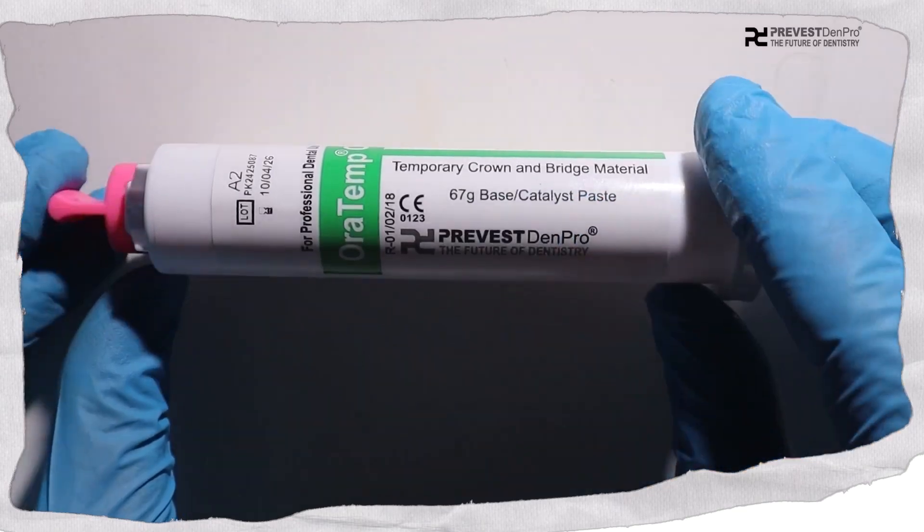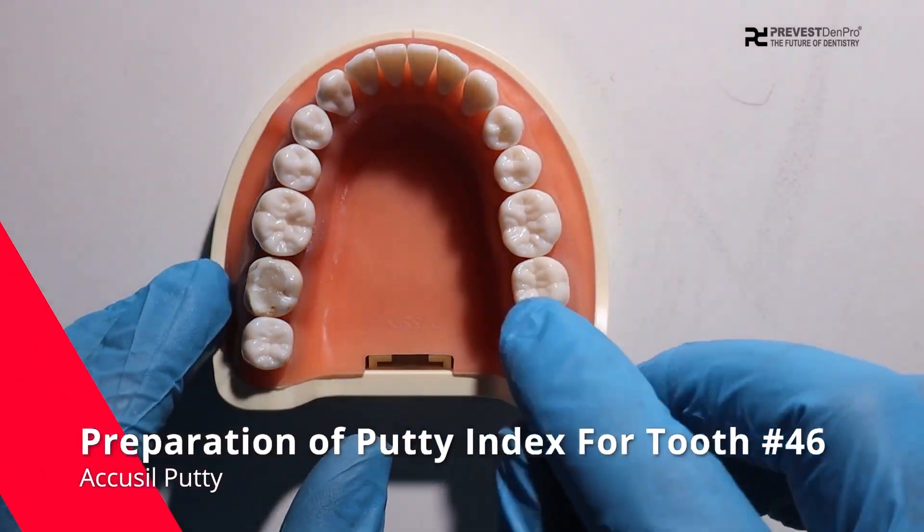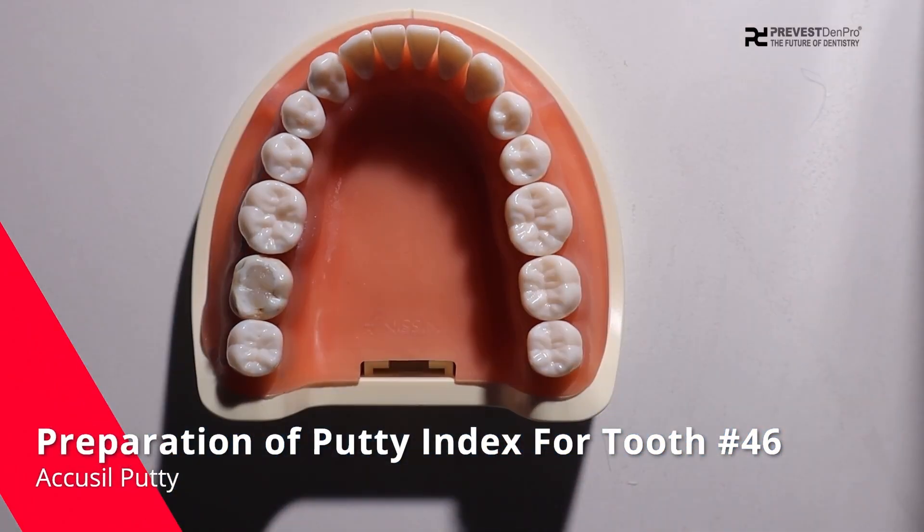In this video, we are going to learn step by step how to fabricate a temporary crown with Oratemp C&B. The first step is preparation of a putty index for tooth 4-6.